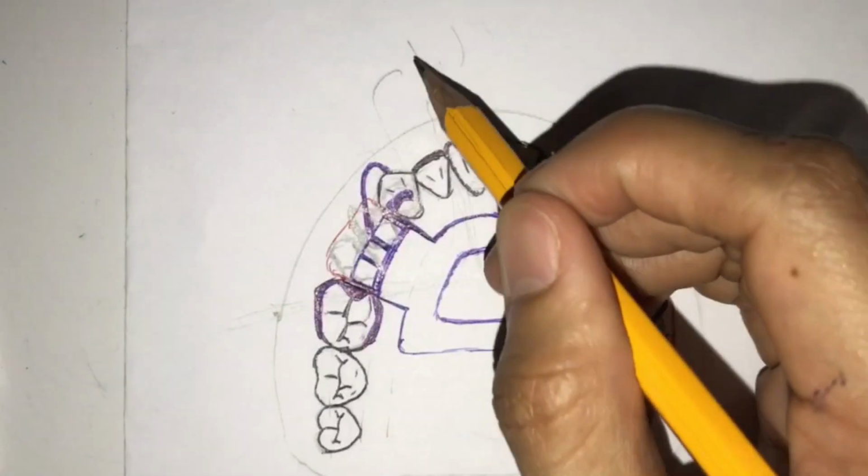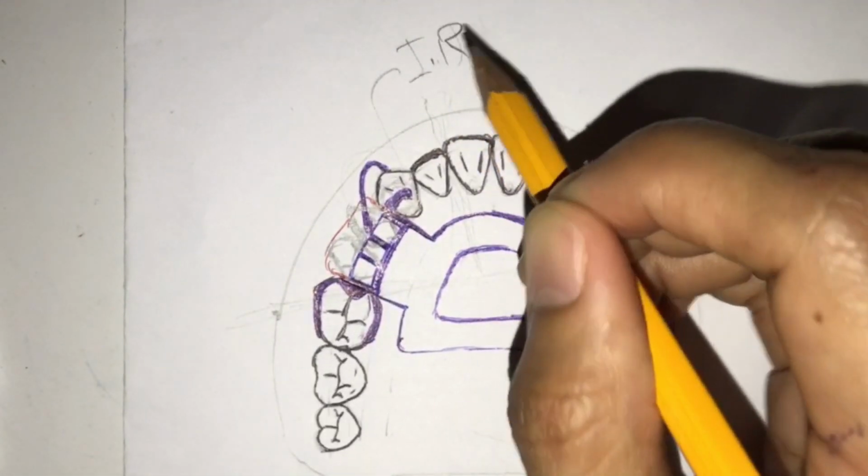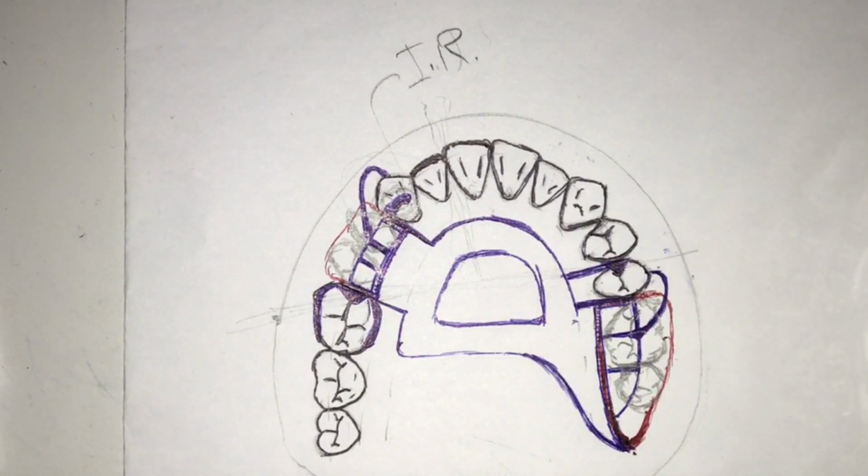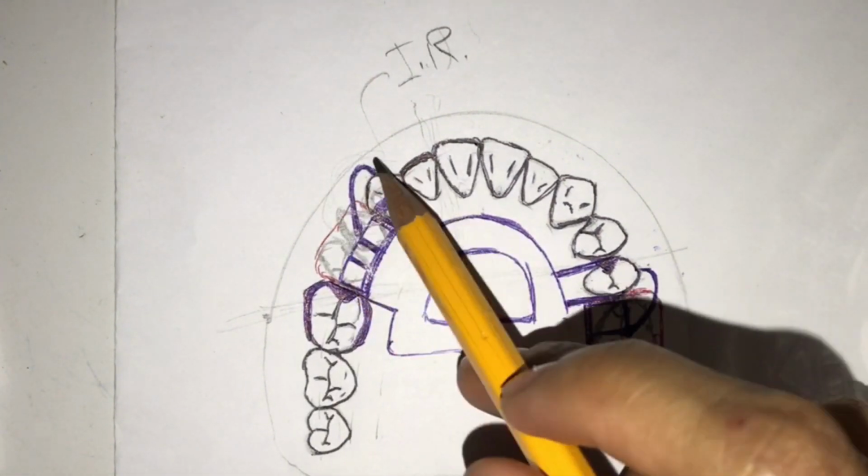So therefore, this rest given by this assembly already acts as your indirect retainer. So this has your dual purpose already. So it's already okay. And then what else?